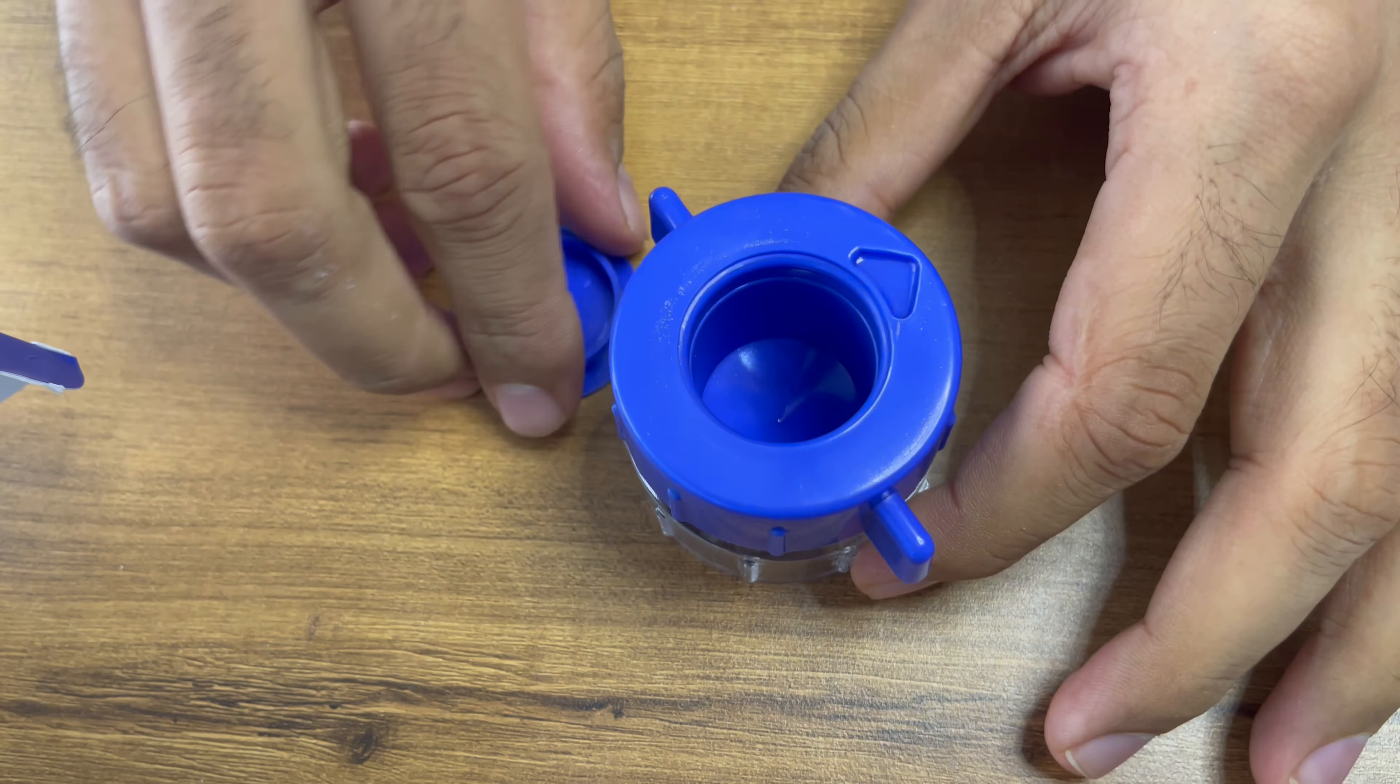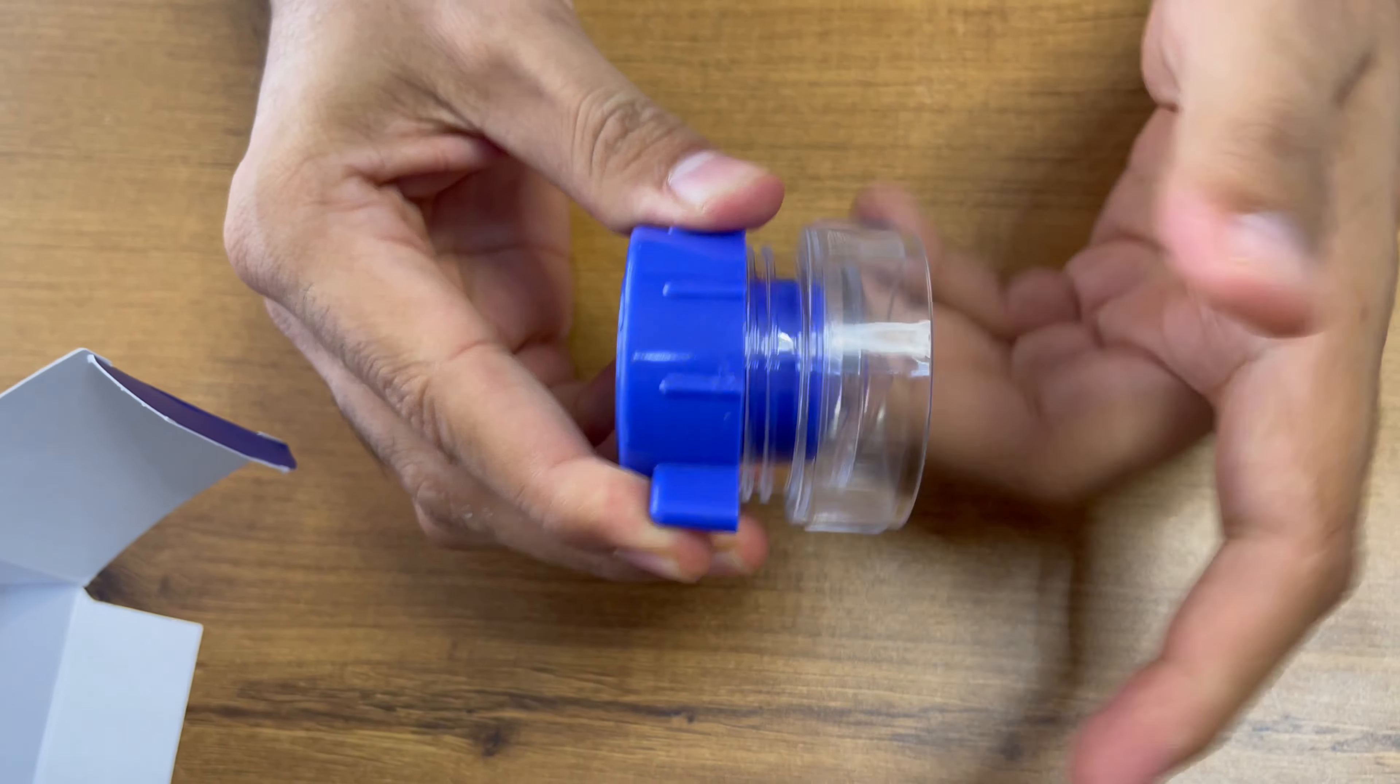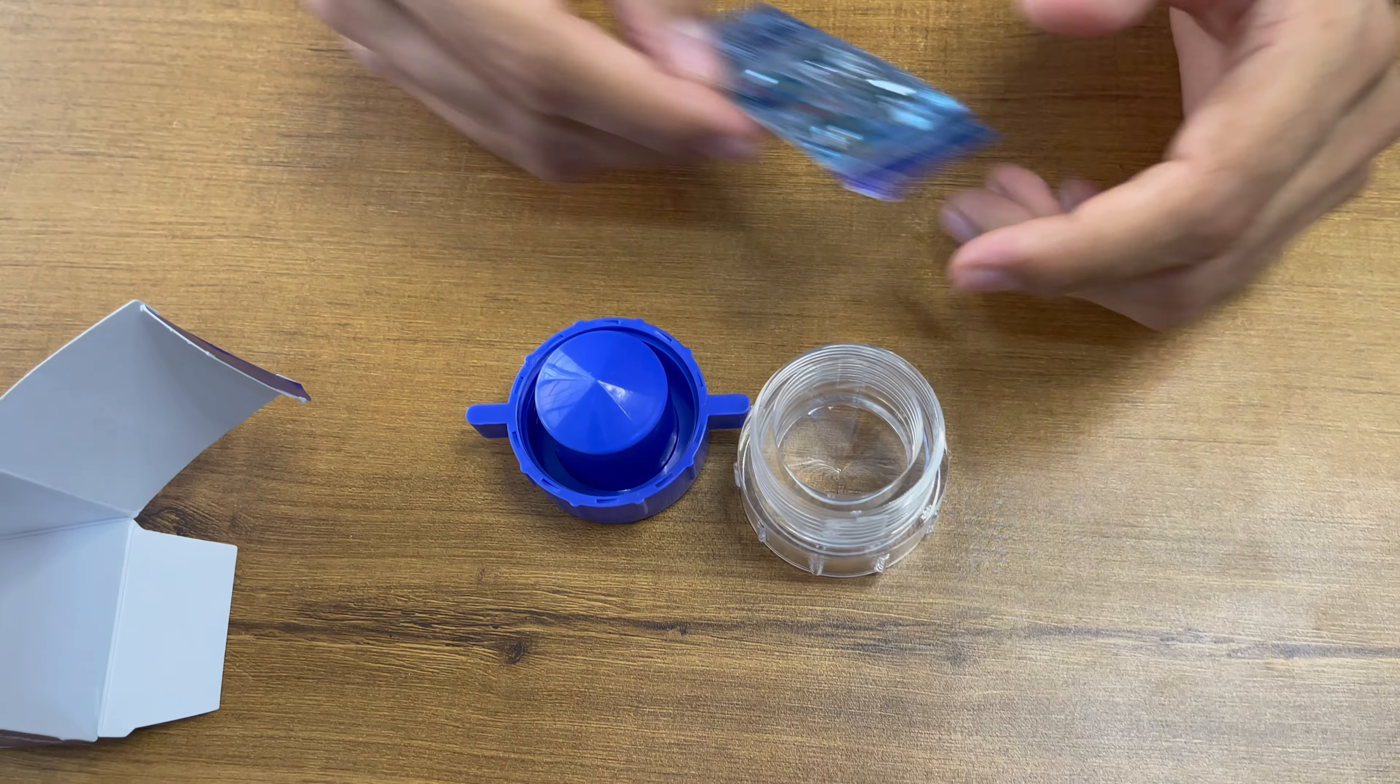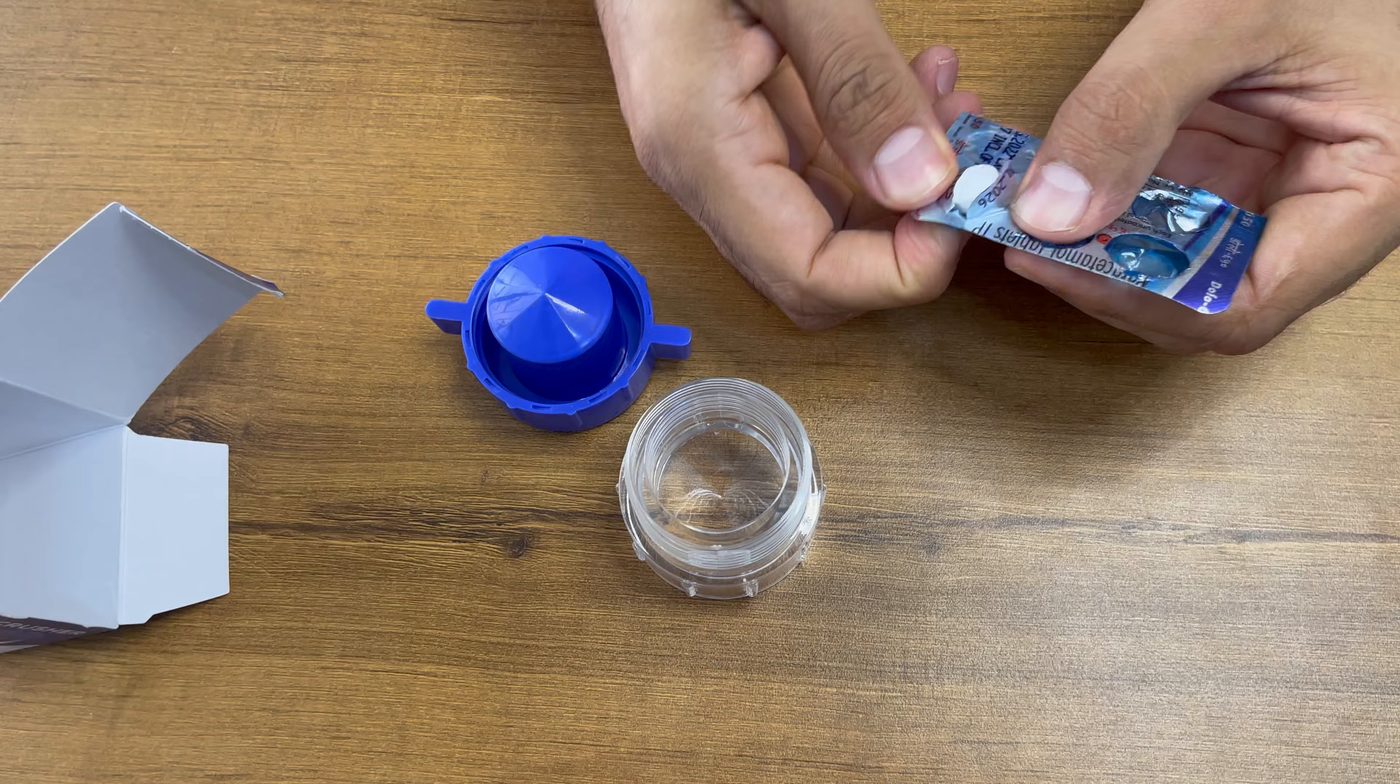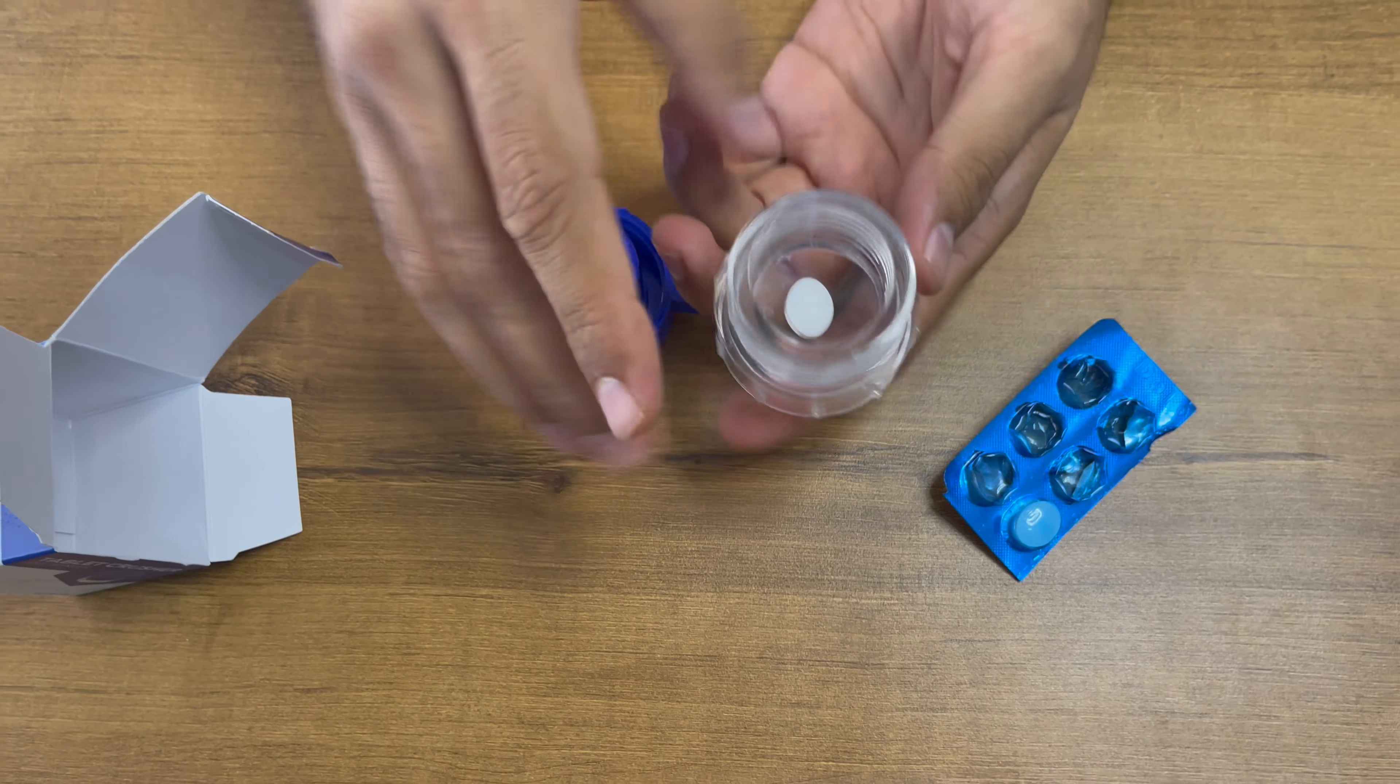You can just close it like this. Now we are going to open the device. We can open it like this and we are taking the tablet here. We have taken this Dolo 650 milligram tablet - the 650 milligram tablet is quite a large one.